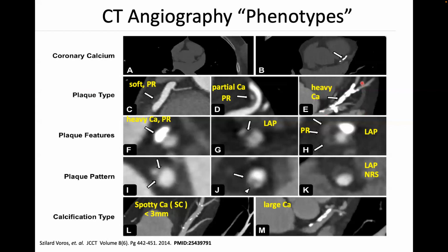This also can be the Achilles heel, let's say, of coronary CTA. If it is so heavily calcified that you can't see any detail inside that vessel in terms of, is there blood flowing through a channel in this heavily calcified tunnel? The blood has this signal amplitude.